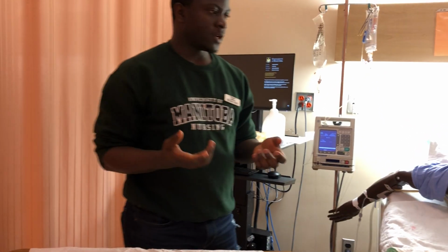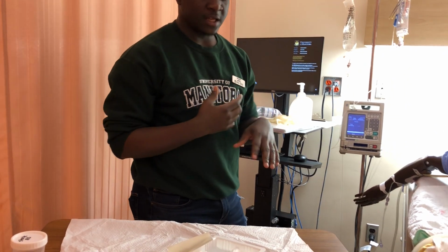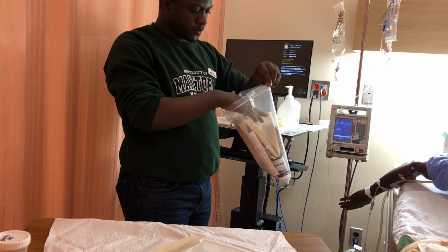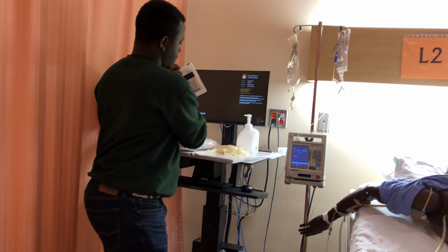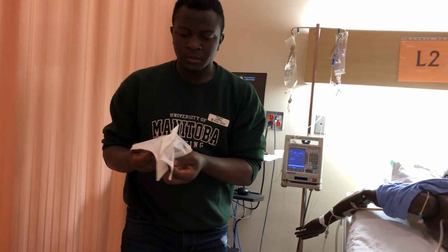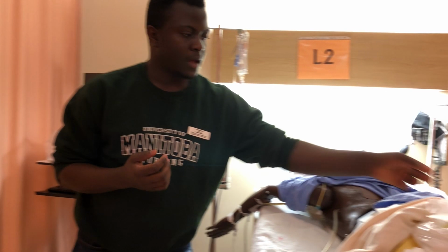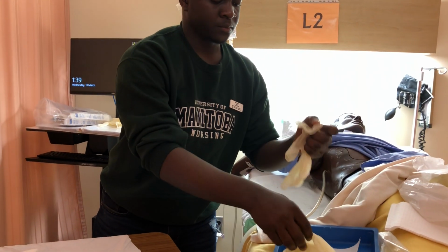And I also notice at this point that I don't have drain dressings in my tray, so before I put on my new gloves, I can just add that to my sterile field. Because once I put on the new gloves, I'm not going to be able to adjust or add anything to my tray with those hands. So I'll just do that now. So I just add drain dressings to my field, and then I can wash my hands again, and then put on my new gloves and open up my sterile field.